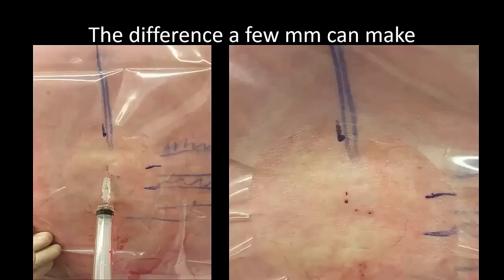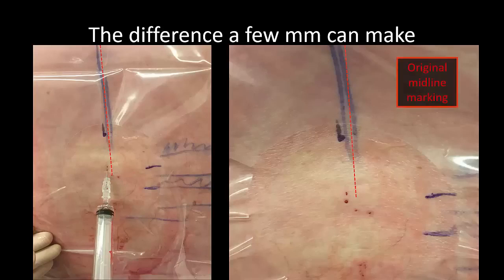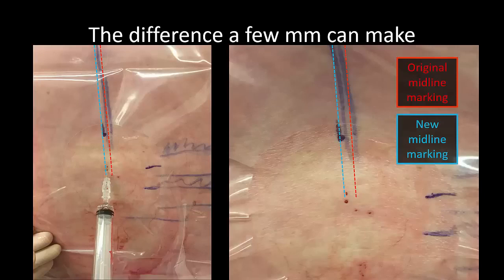Just so that you can appreciate the difference a few millimeters might make, in this obese older gentleman, we scanned and marked his midline and spaces. Due to a surgical delay, he was allowed to lie back down and was later sat up again for the spinal. Initial attempts using the original markings were unsuccessful because the skin was now in a slightly different position and he had very narrow spaces. We rescanned as a rescue, and you can see the difference between failure and success is only a couple of millimeters.